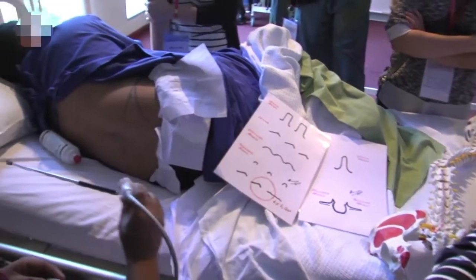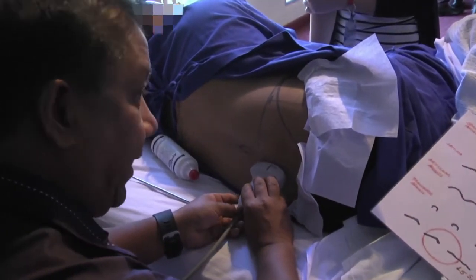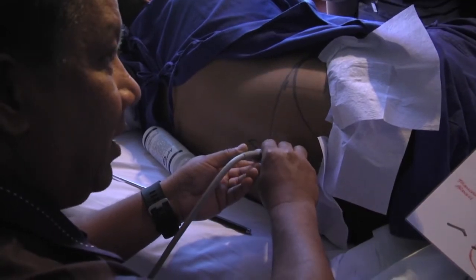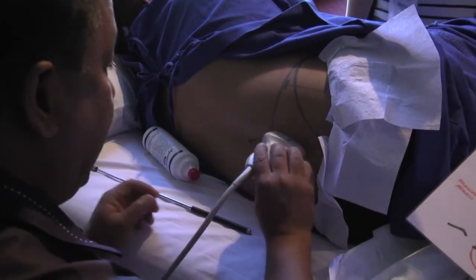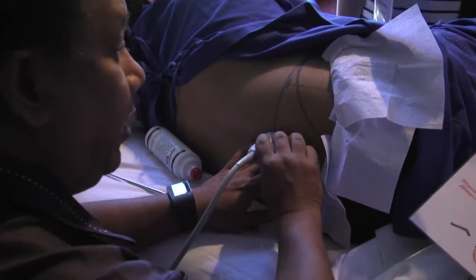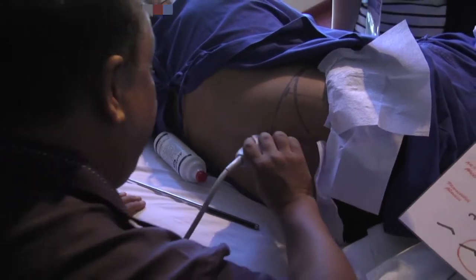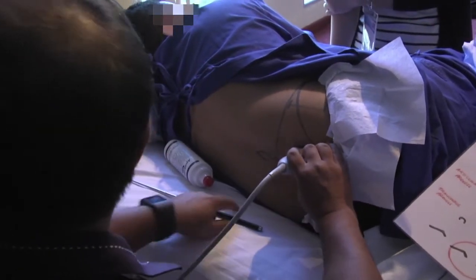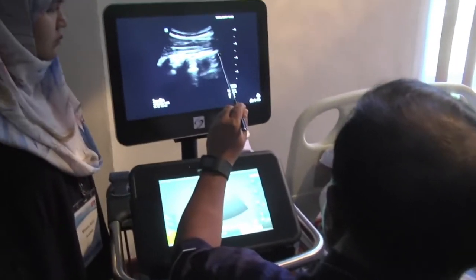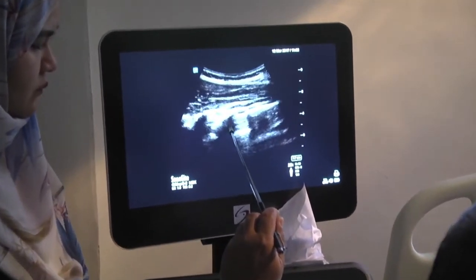So the same applies here. Now if you are on the dependent side, then you should really tilt it like that, yeah? But if you are in error, you will do this. You're going to go away from the neuraxis. So palpate the spine before you put the probe and just put it on top of it. So you now know you're on the non-dependent side, yeah. Good, so I'm going to start from the sacrum. You see here, this is the large flat surface of the sacrum, okay? What is this? L5 what?